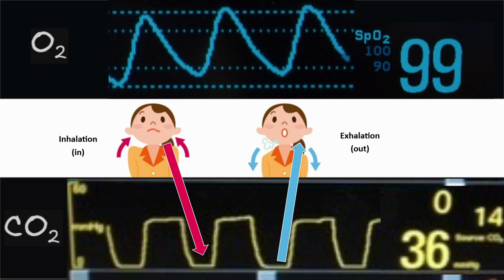But we have to be careful, because if I just showed you these two pictures in the middle near the red arrow here and said, what is this? You would have no reference point. Unless you had a gauge here that said 60 is probably what that says, or a 35, these are just arbitrary waves, and there could be arbitrary rates. If this guy doubled his respiratory rate, we would see more of these closer together. If he slowed his respiratory rate, we would see fewer of them and farther apart.